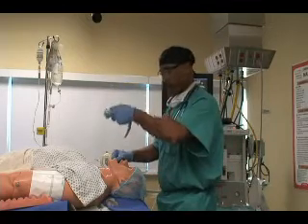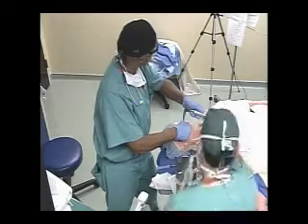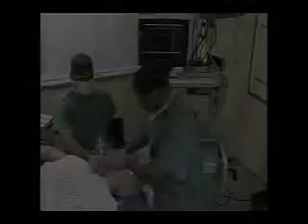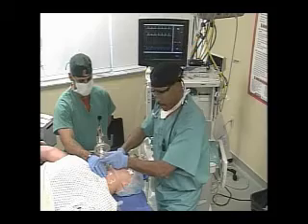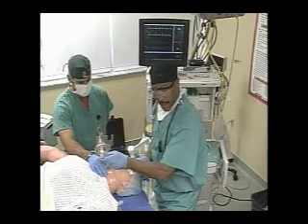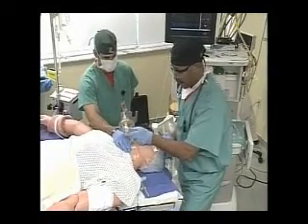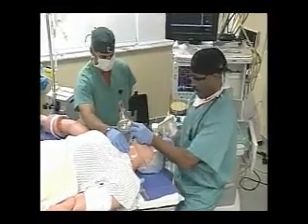If you have a straight blade, place it to the right and slide it down the tongue. If it's a curved blade like so, just straight down the tongue. At this point, you want to make sure there's no lips, no gum, no teeth on your blade. Insert your laryngoscope, lift, and get a good visualization of the cords.